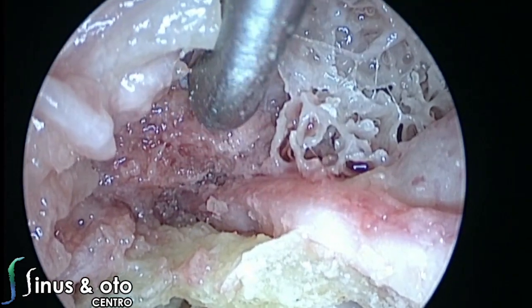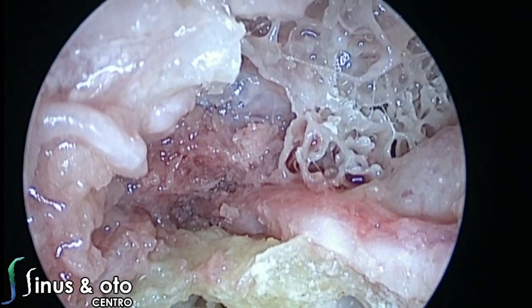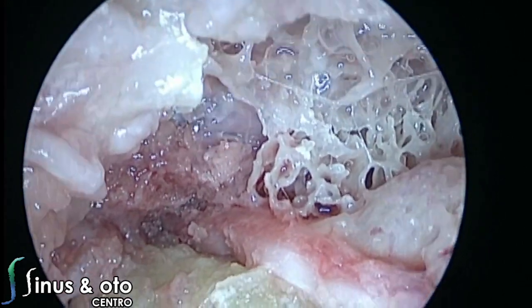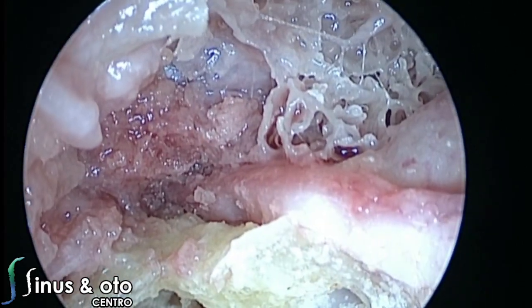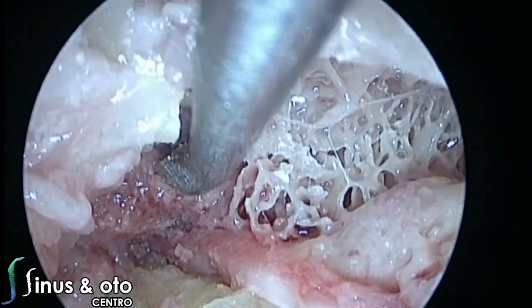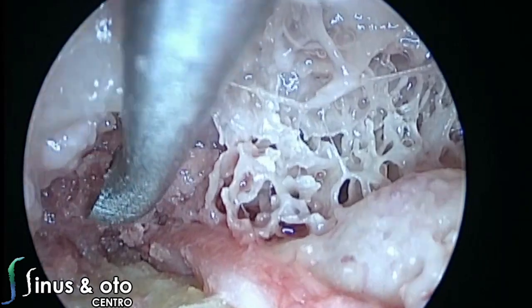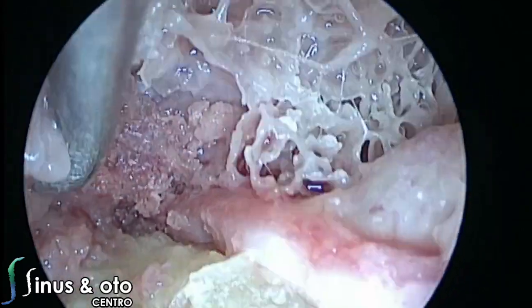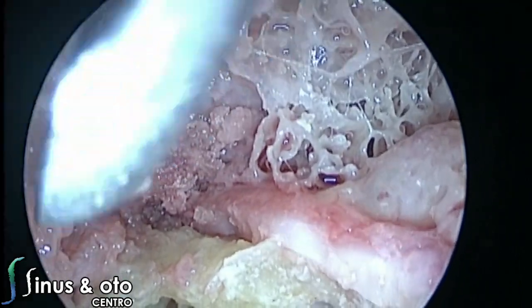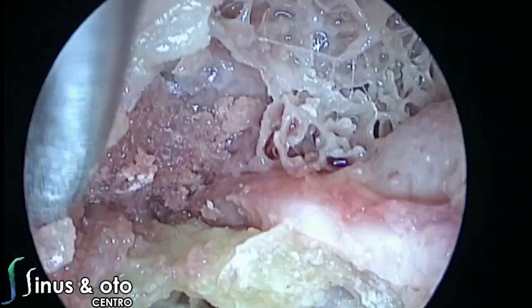This is one of the approaches that we can perform endoscopically for lesions that are above the geniculate ganglion. So a suprageniculate approach can be performed this way. Of course, you have to have disease, because if you have disease, you have at least space between the geniculate ganglion and the middle fossa dura.